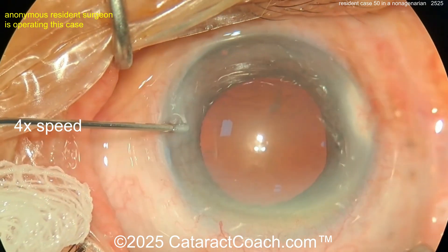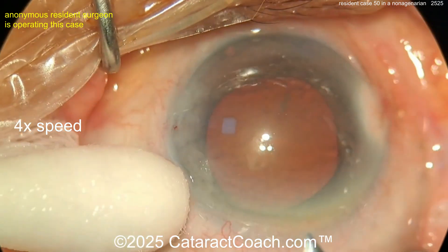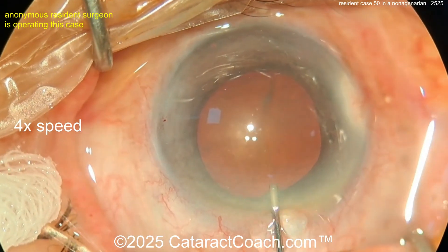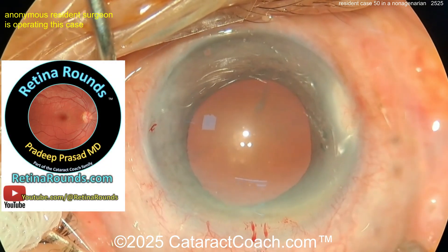Here's the paracentesis — and notice it's normal to have some struggle getting inside. It happens to all of us. Be careful not to inject viscoelastic until you're sure the tip is in the paracentesis and in the anterior chamber, because you don't want to dissect the corneal endothelium off. Now here we go starting off the case — the incision looks reasonable.